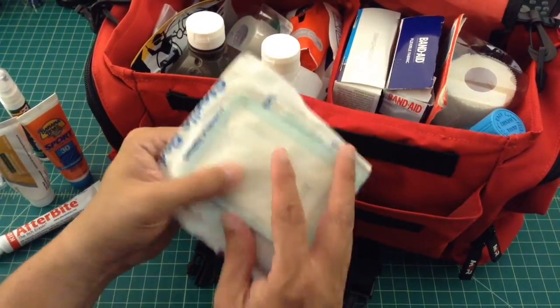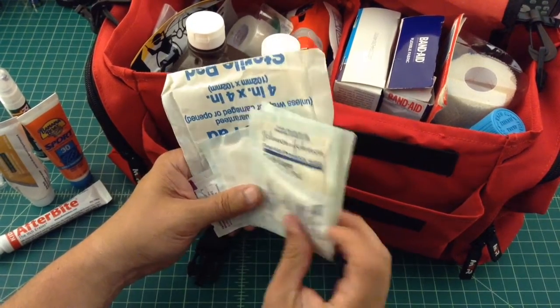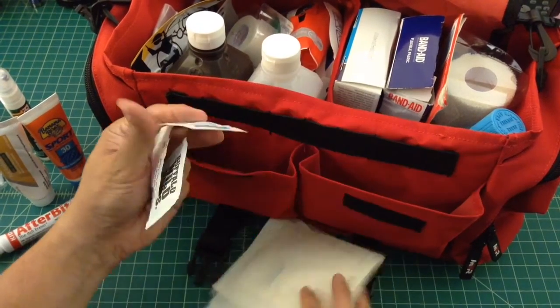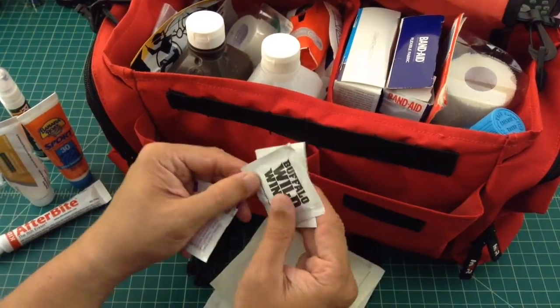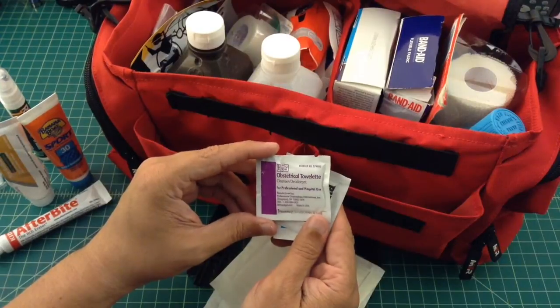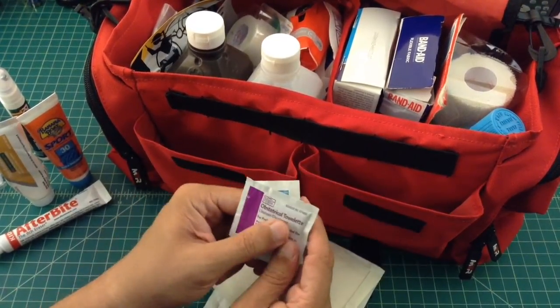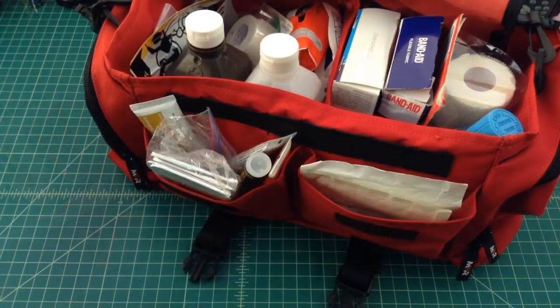In this pouch I try to keep gauze, so we have a couple different types and sizes — here's a four-by-four and some other stuff thrown in. There's also some ibuprofen, Buffalo Wild Wings wipes, and some sort of cleaning disinfectant towelette.